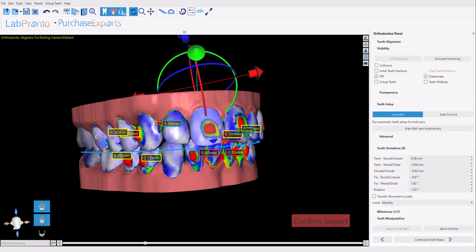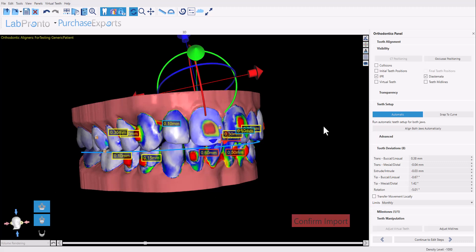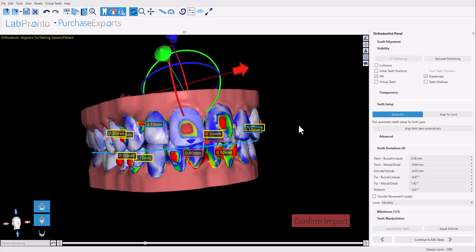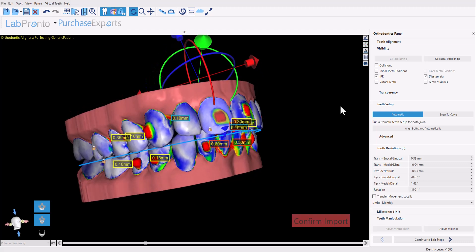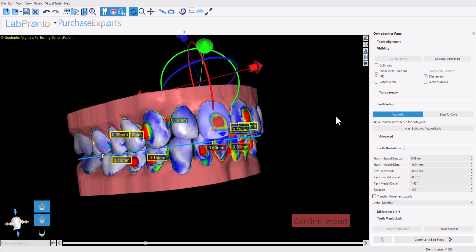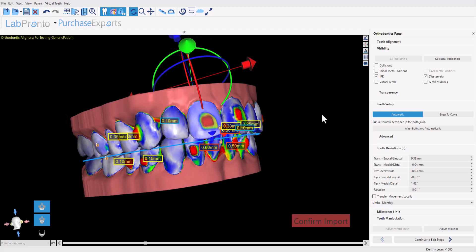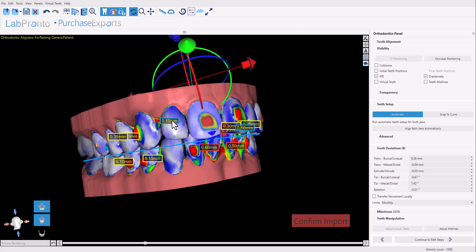You will never have to replan a mid-course refinement case again with this new functionality in BlueSky Plan. This is Michael from BlueSky Bio, and in this training tutorial, I will demonstrate our new automatic replanning functionality for those mid-course refinement cases.